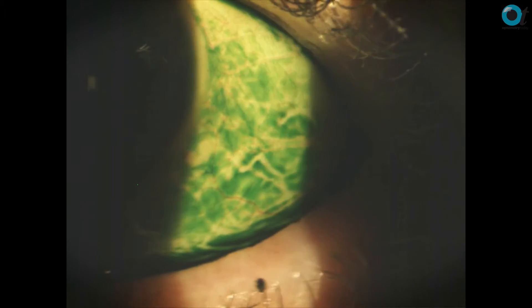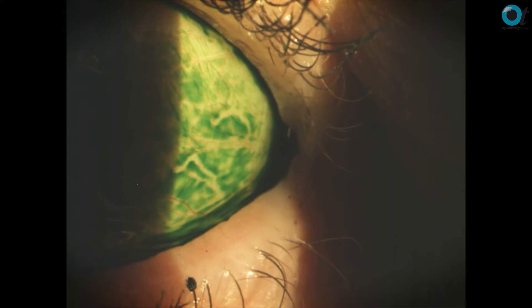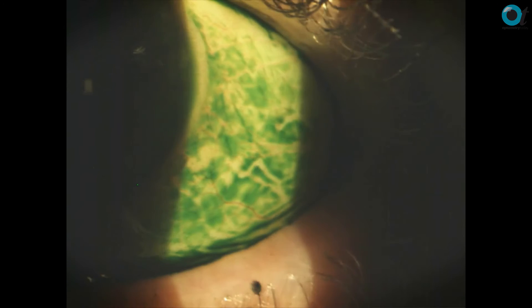You can definitely see how dry this patient is by this green stain. She's staining beautifully with lissamine green in the nasal area, and you can also see that she's fairly hyperemic as well. Redness and dryness are linked — the drier you go, the more hyperemic you become. A lot of computer users end up with pink eye by the end of the day after 12 hours on the computer, because their eyes are so dry from central heating or air conditioning and not blinking.